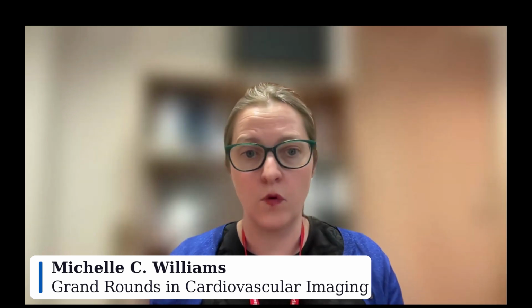With regards to plaque quantification and pericoronary fat, would the widespread use of photon counting scanners that is expected in the near future challenge the current cutoffs and our knowledge in these two fields? Yeah, really important question. So last year we published a paper along with Pal and Marton, the team in Hungary, looking at how plaque is different from a quantitative point of view across the coronary artery tree in photon counting CT scans with different energies.